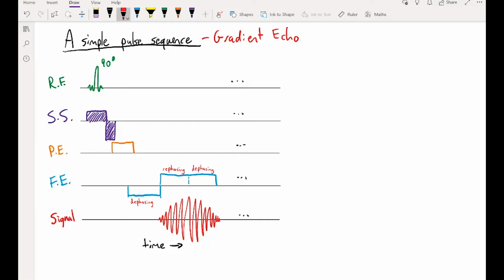And this essentially is where time can add up and cause our MRI sequences to take minutes instead of just milliseconds, because we need to do the same pulses again and again under different conditions to collect information from other parts of the brain, which might be a little bit unclear.